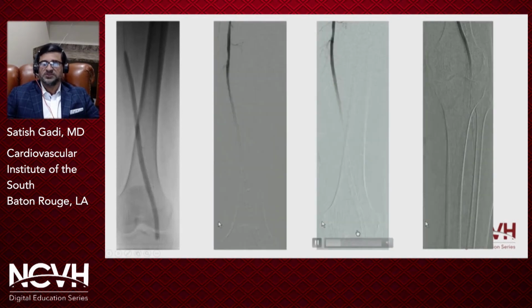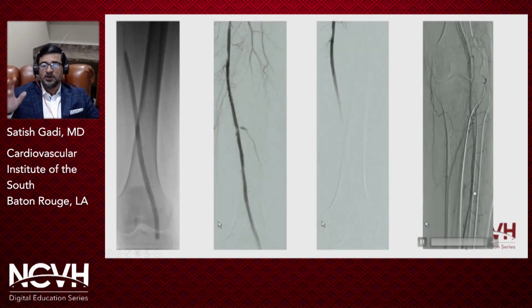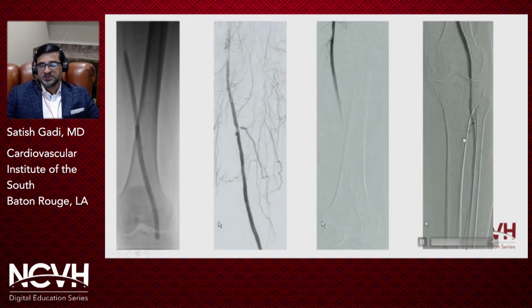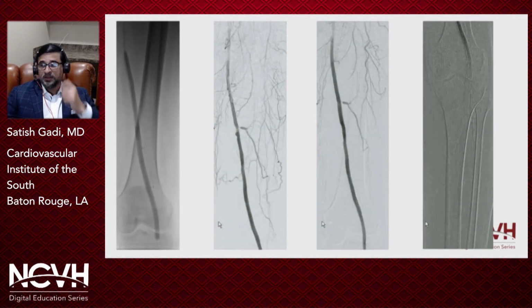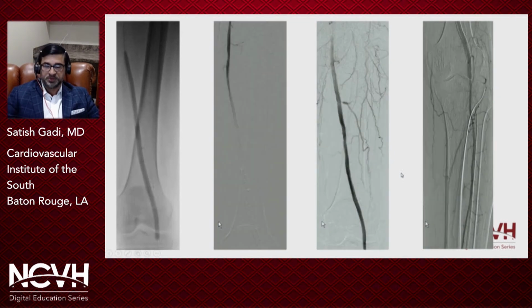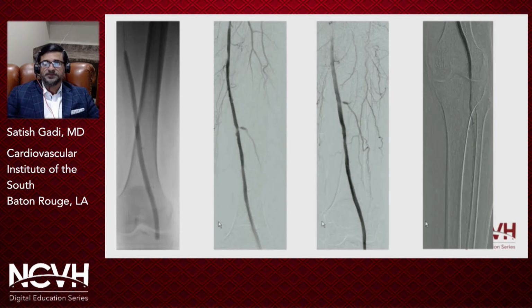And this time I paid more attention to the distal runoff, made sure the distal runoff was good. In this case, she had a good single vessel runoff that seemed to be pretty brisk with no other issues, and subsequently the Supera patency was maintained.